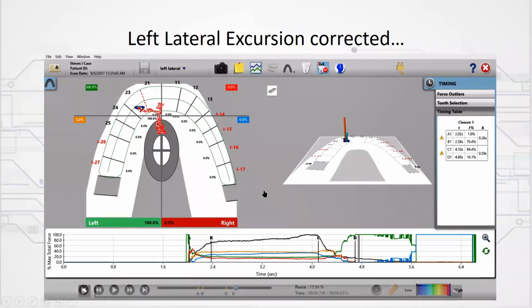And this is how you manage the cases. This is how the case could have been delivered, which is really the important thing I want you to understand. You can use the T-scan at delivery. It saves you a lot of difficulty in the aftermath.